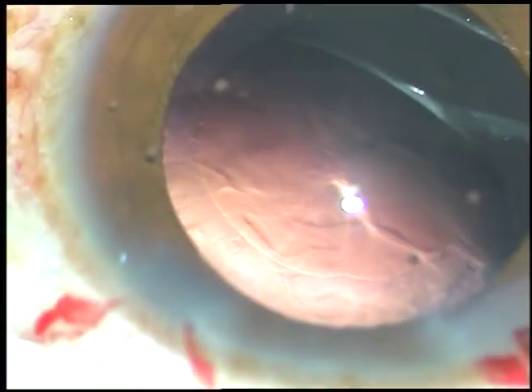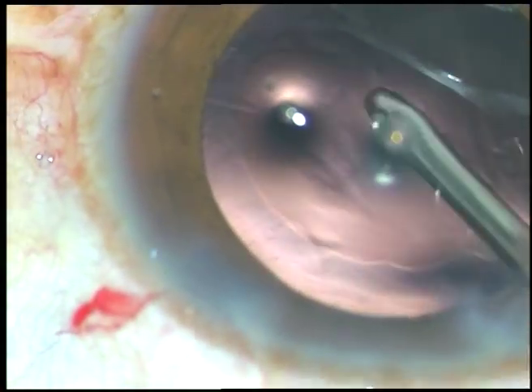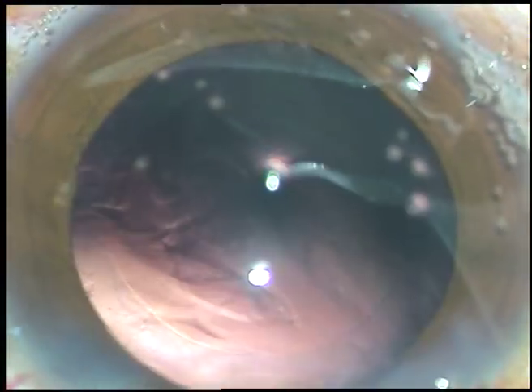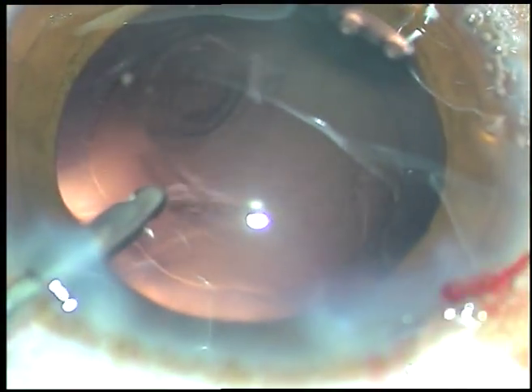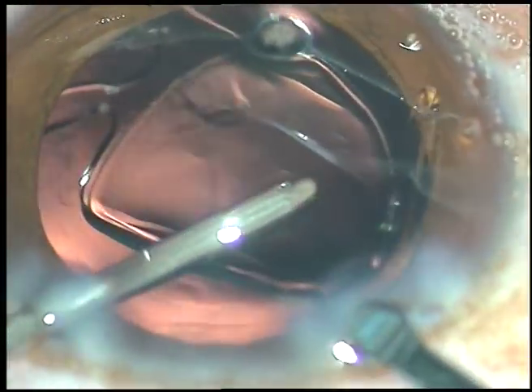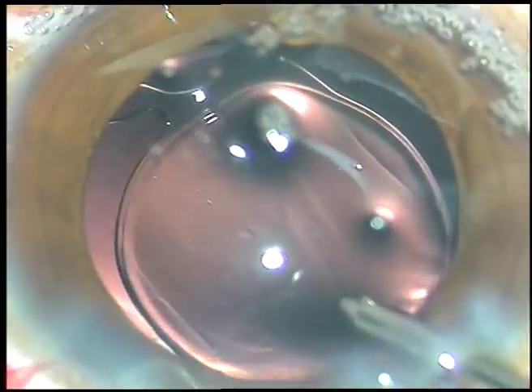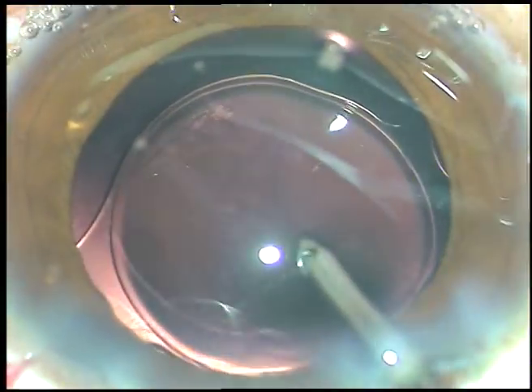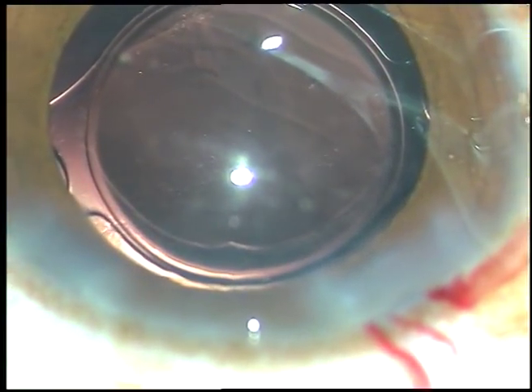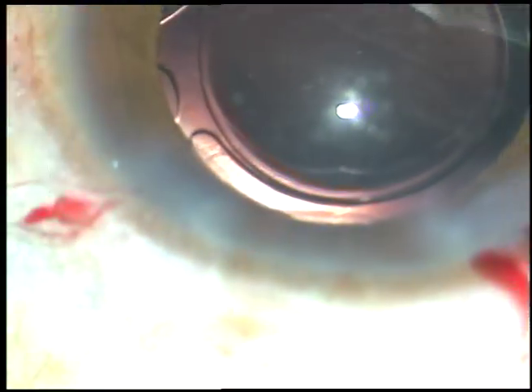Work at a respectable distance from the corneal endothelium. Respect the corneal endothelium more than you respect the posterior capsule — because if there is damage or a rent of the posterior capsule, you can manage. But if there is corneal damage, you have to depend on donor tissue. This is IOL implantation under irrigation. Irrigation keeps the anterior chamber formed and the IOL is implanted. Since there is no viscoelastic substance used, the time that would be needed to remove the visco has been saved.